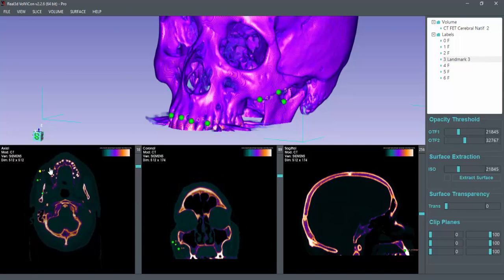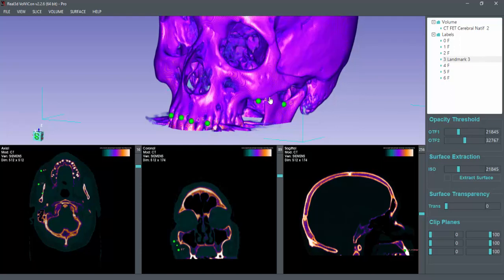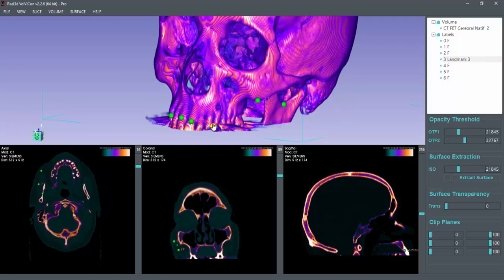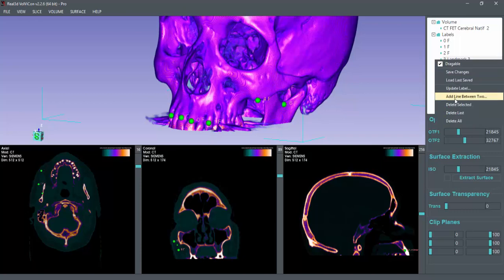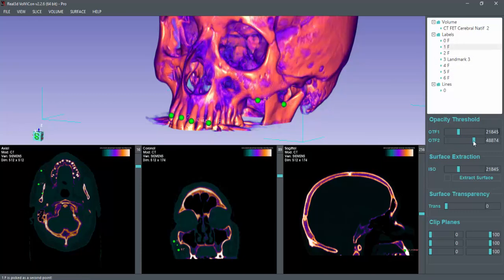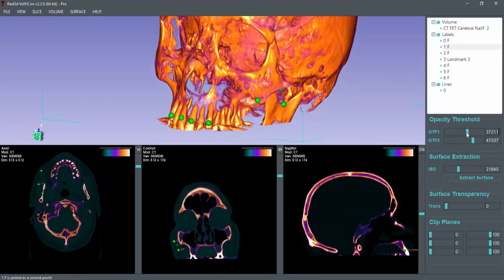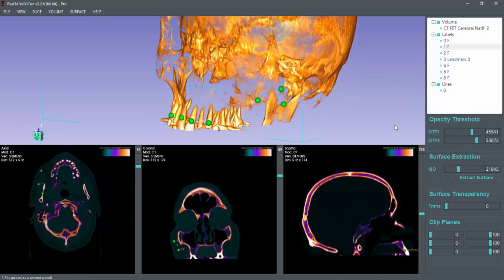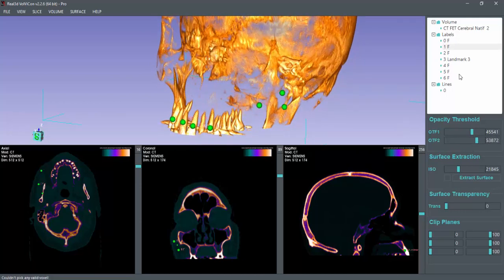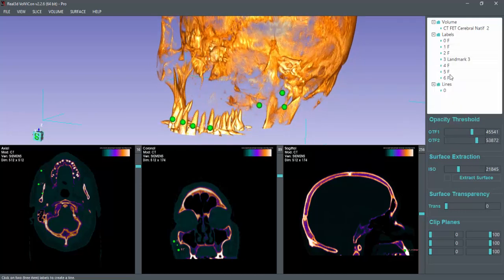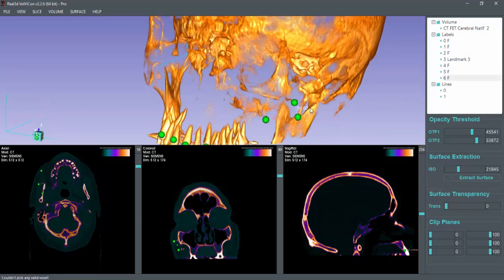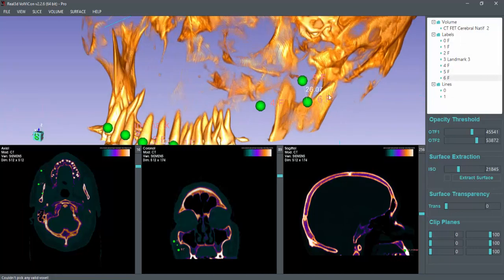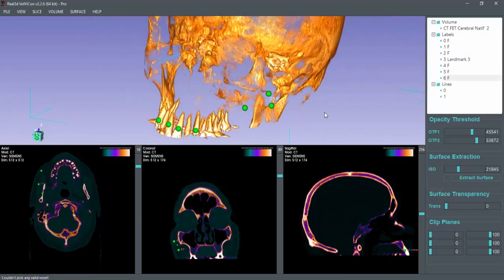You can see there, so you can actually place the points using mouse clicks. You can draw a line between two points and you can get the distance between these two points.